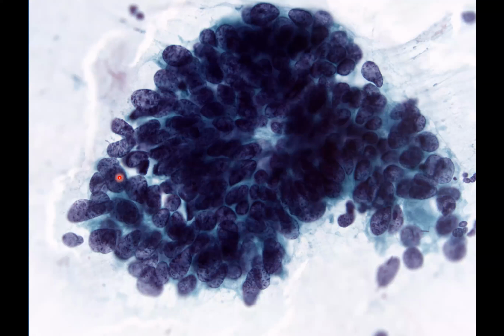In some groups, the nuclei look paradoxically much smaller than you would expect them to be. In others, they look the same size, or indeed, and here I would say the nuclei look larger than normal endocervical cells. We've got this super crowded glandular group, and the best way of imagining this is it's almost like an Elizabethan ruffle. If you imagine Elizabeth I's neck here, and this is this lace ruffle, this super crowded group around it. And you can begin to see a little bit of feathering, a little bit of elongation at the edges of this group.